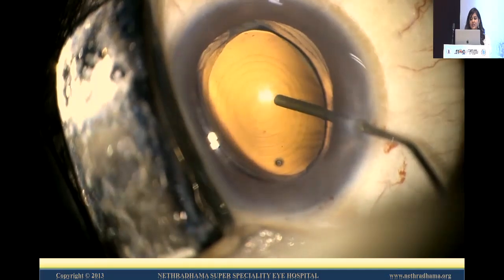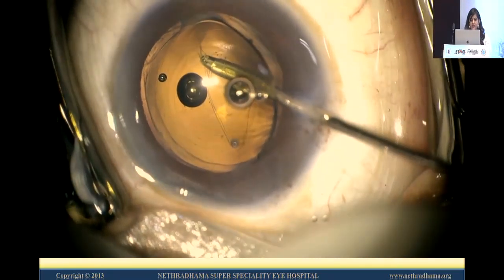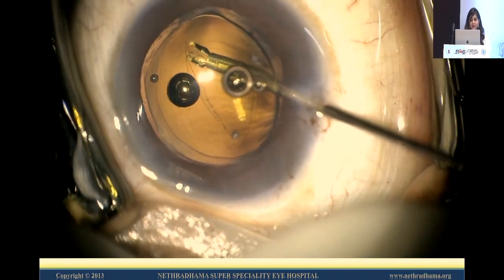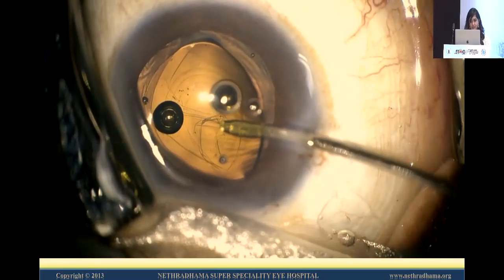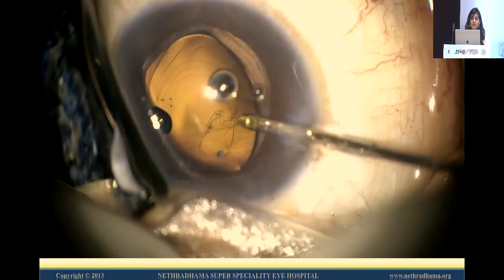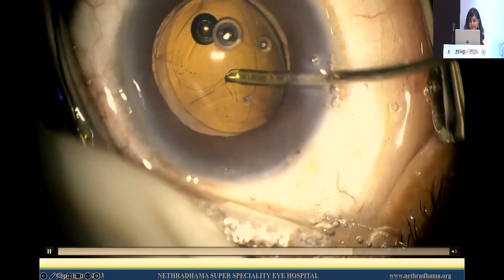So after making the initial nick, sodium hyaluronate is injected to push down the vitreous. And you can see here very carefully a posterior capsulotomy being done using a microrhexis forceps. The reason the posterior capsulotomy is being done is to try and capture the IOL in the posterior capsulotomy and push it backwards so that it negates the myopia.